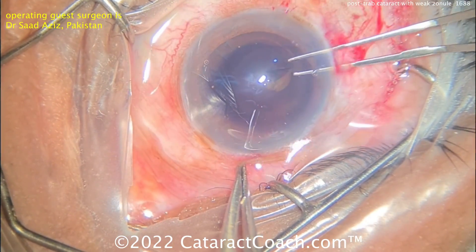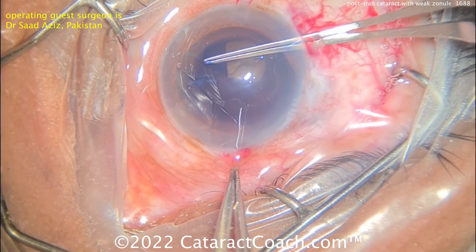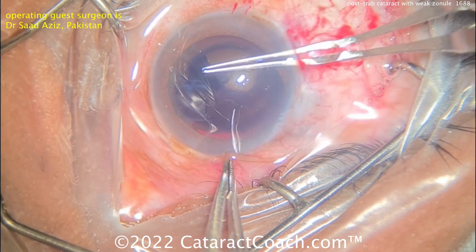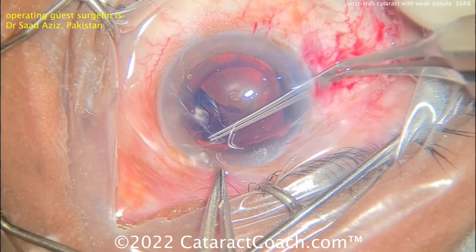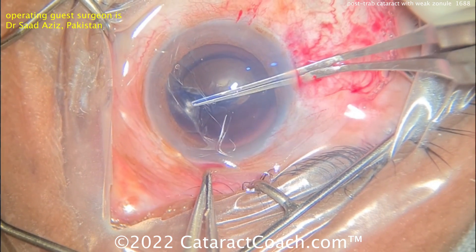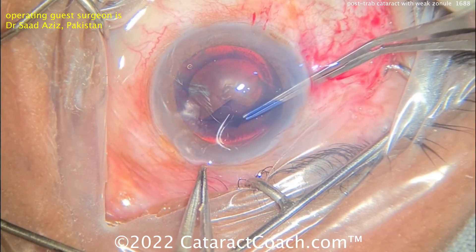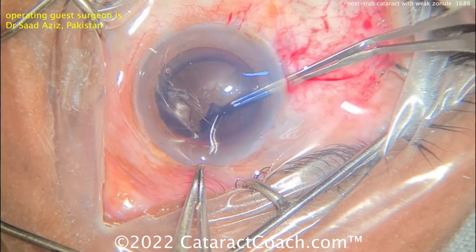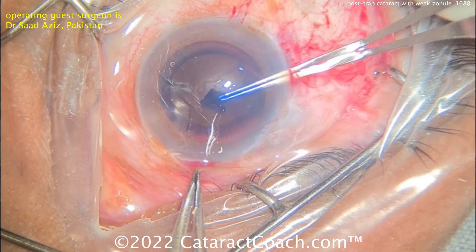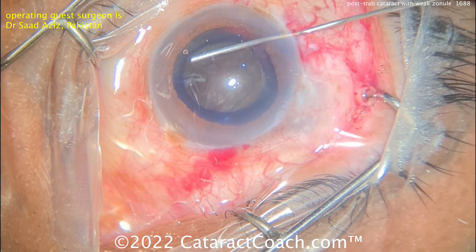Here comes the rhexis, starting off here with the capsulorhexis forceps, and that looks pretty good. Oftentimes, if you have very weak zonular support, you can tell as you do the capsulorhexis — there'll be wrinkling of the anterior lens capsule. Here it looks pretty good, not a whole lot of wrinkling. It looks reasonably supportive enough to get this rhexis done nicely. I'm glad you used the trypan blue dye — it makes the visualization easier.